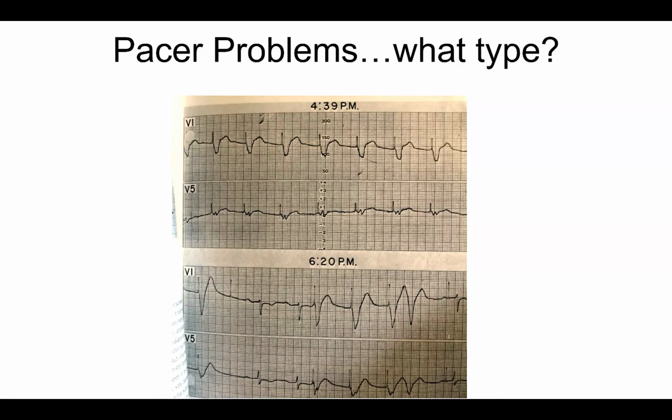Now, there are electrocautery tools that are less likely to do that. Some of you have seen Barry and me do pacemaker surgery using a so-called plasma blade, which is made by Medtronic, which is supposed to not cause as much artifact. There are also bipolar bovies, where instead of a single stick used to cauterize, the device looks like a pair of forceps, and it cauterizes between them, and that's also safe. There's also something called a harmonic scalpel that uses ultrasound. It's very uncommon to find these in the present era, but all of those devices could theoretically be safe with a pacemaker.